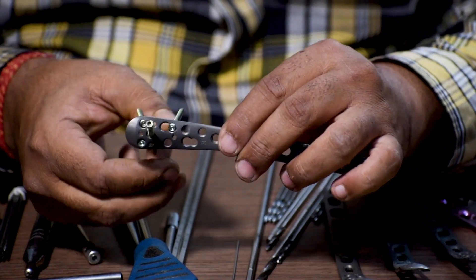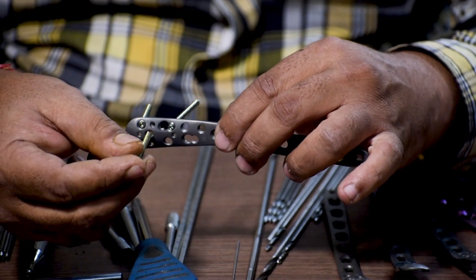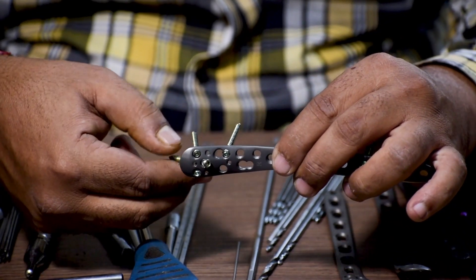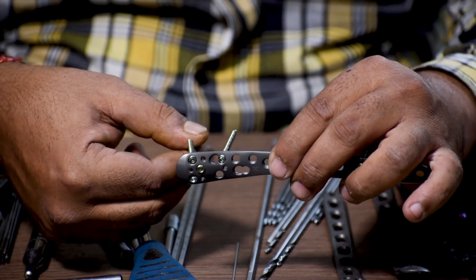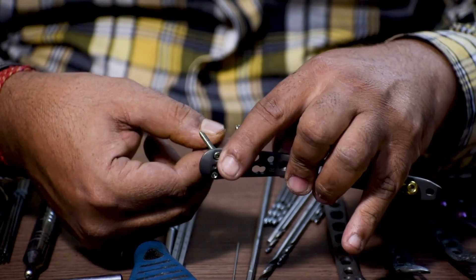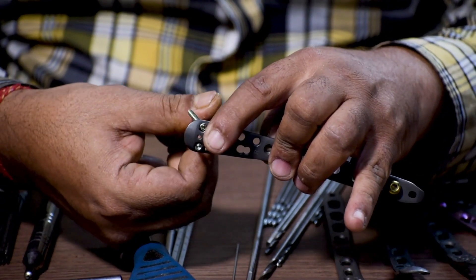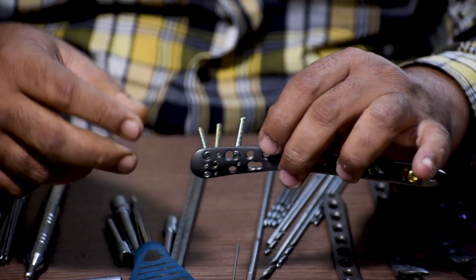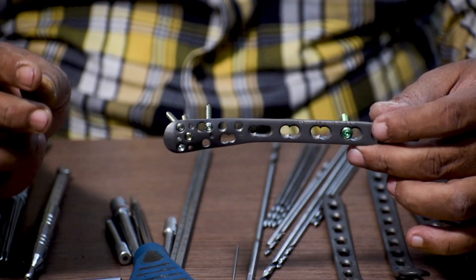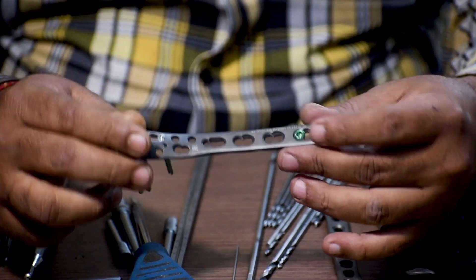Always remember, the center hole in the distal part of the plate is fixed with a screw which is longer in length. This is the main screw, and it is the screw that holds the fracture together. For any other screws that are required to be fixed, we use the same procedure.